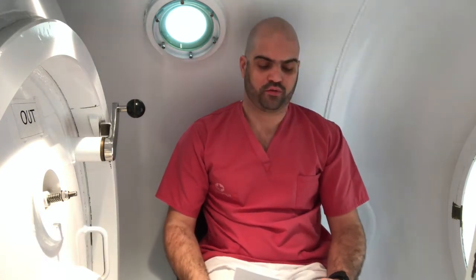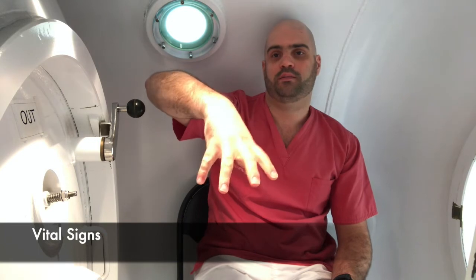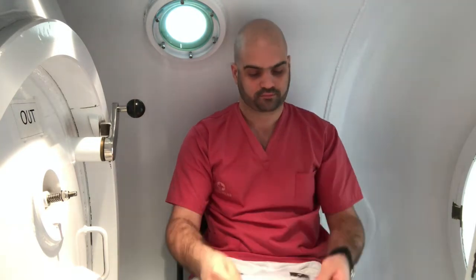If you want to refer to measuring the vital signs of the patient, we have this sign, okay? This means measure the vital signs of the patient, or in case the tender is doing that signal, it will mean to the operator to help you count the time when you are measuring the vital signs of the patient. Also, of course, it is a sign to tell the operator, do not make any noise because I will measure the vital signs of the patient.